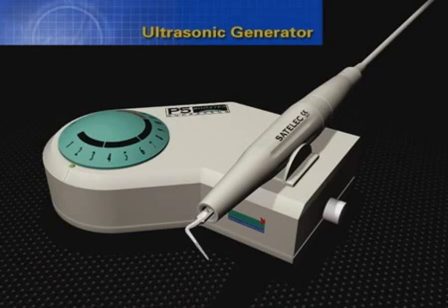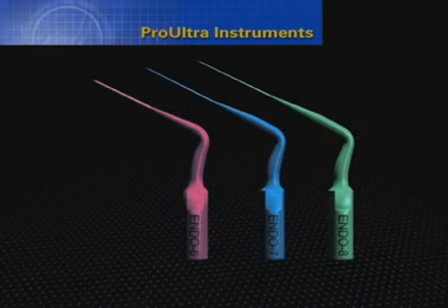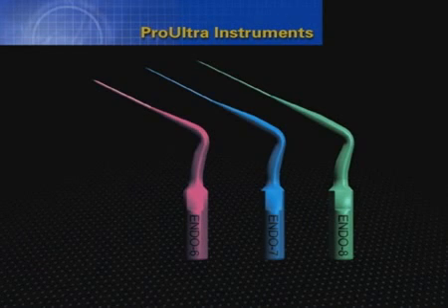At lower power settings, this generator will deliver a gentle vibratory wave through an instrument, which in turn delivers MTA into a root defect. In straighter canals, MTA can be gently vibrated, moved into the defect, and adapted to the canal walls with a titanium Pro Ultra Endo 6, 7, or 8.